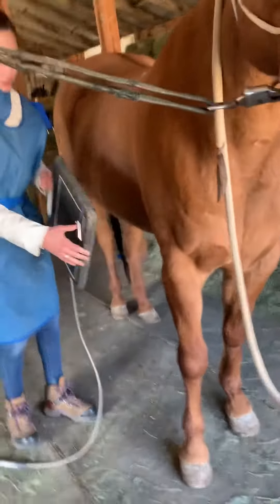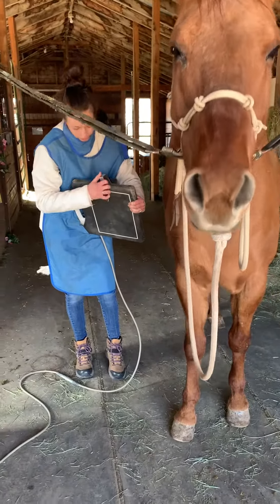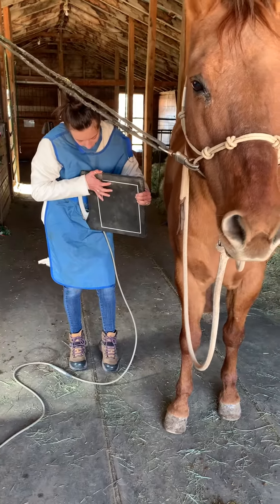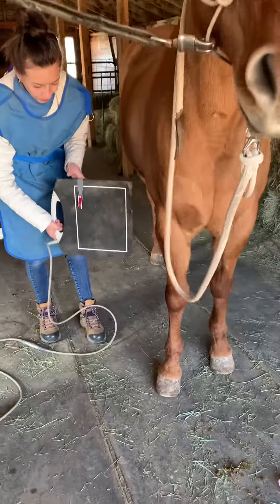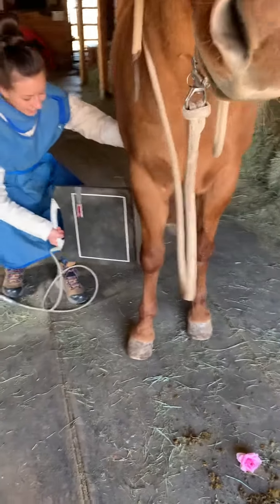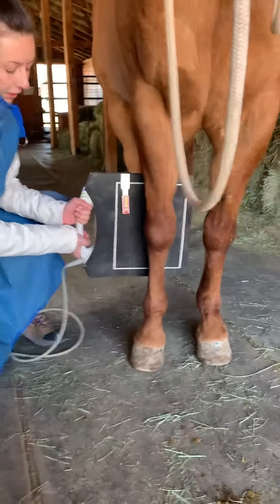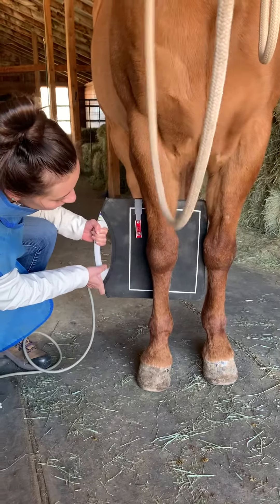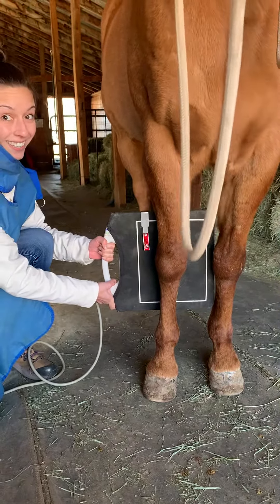And then for the DP view, you know the marker — here. And the other side, the lateral side. I'm covering. And the other one. There. And there. Good.